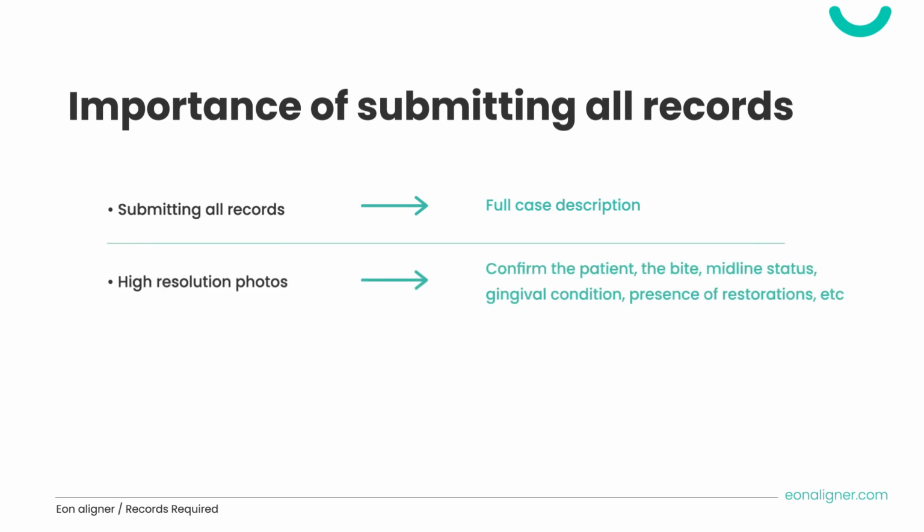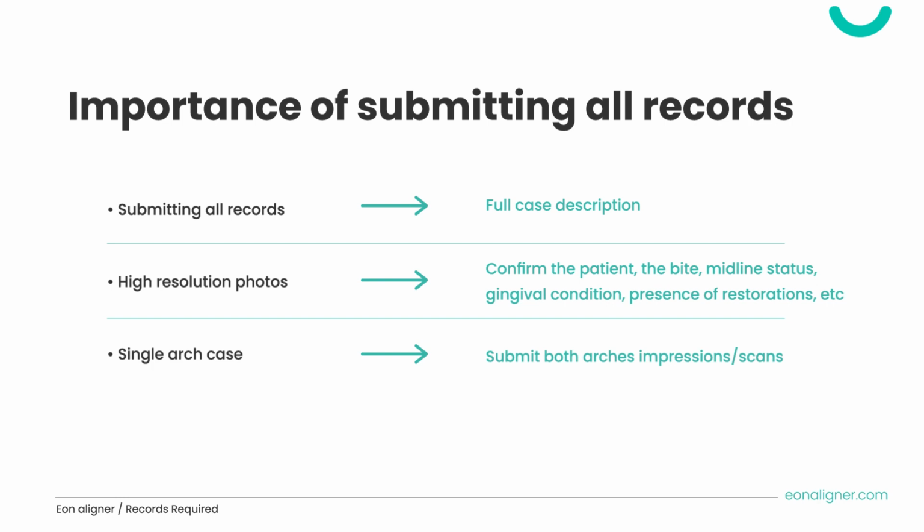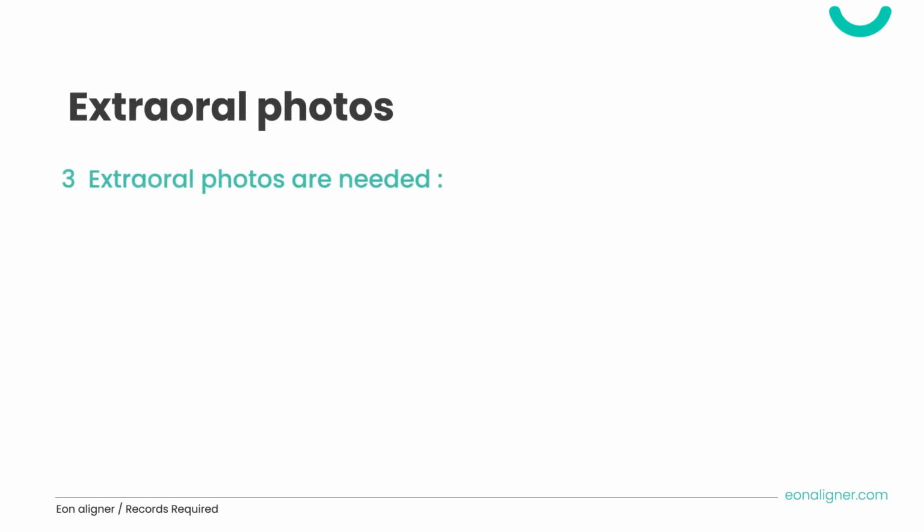High-resolution photos, i.e. intra and extraoral, are important to confirm the patient's ID, the bite, midline status, gingival condition, presence of restorations, etc. Single arch cases require submitting both arches' impressions or scans and a bite registry, as the TS is to be generated based on the patient's bite to avoid any interferences. Now we'll walk through each record in detail.